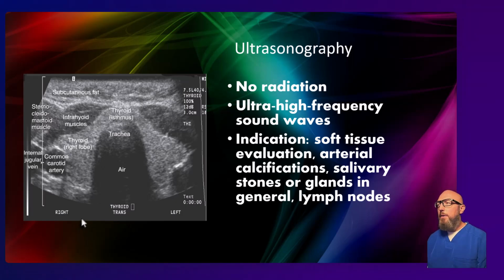All right, then what about ultrasonography, ultrasound? There is no radiation, so very safe. It uses an ultra-high frequency sound wave. And this is used for soft tissue evaluation in the head and neck, salivary glands, lymph nodes, salivary stones, or just looking at the salivary glands in general.